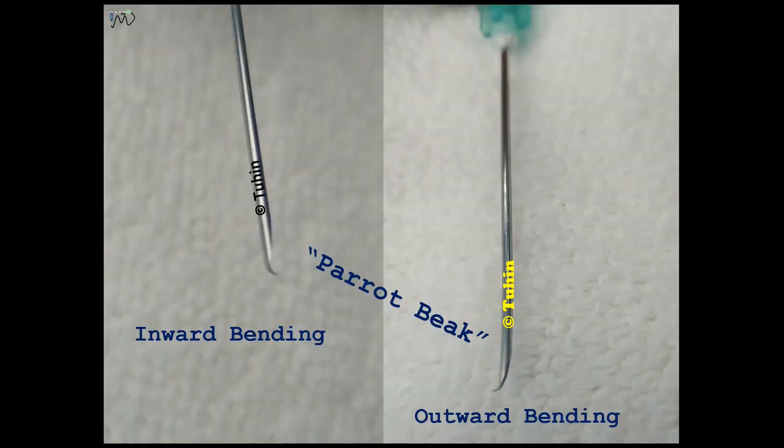When the needle tip bends towards the bevel it forms a parrot beak or inward bending, and when it bends opposite to the bevel it forms an outward bending.